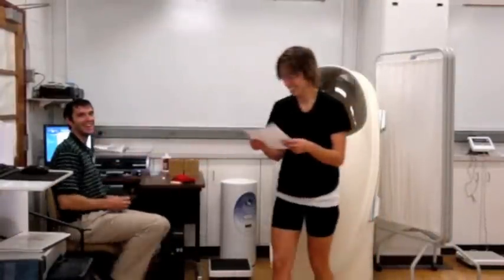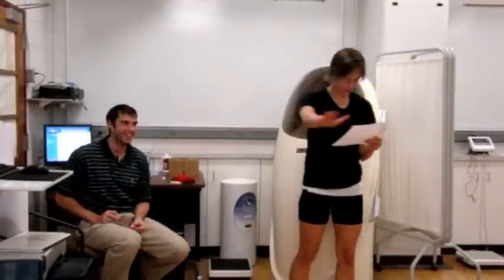This completes the measurement procedure and results for percent fat and fat free mass are displayed.